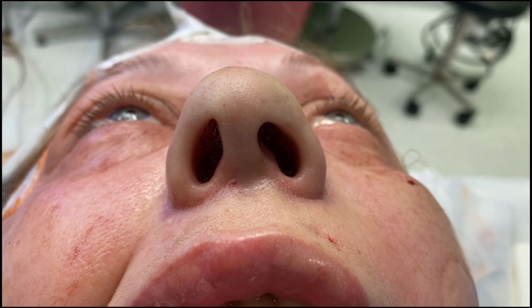But that's common, so let's see. There, that was one. A little tiny one. She coughs again. When you extubate her, for sure she'll do it. You know? Oh, I saw a flicker in the lip, so that's good. It's very hard. Ask her again.